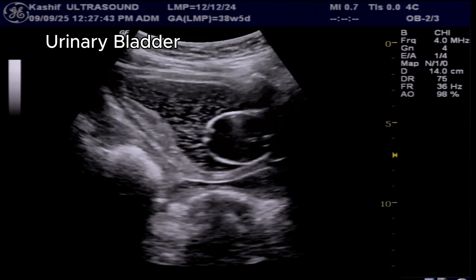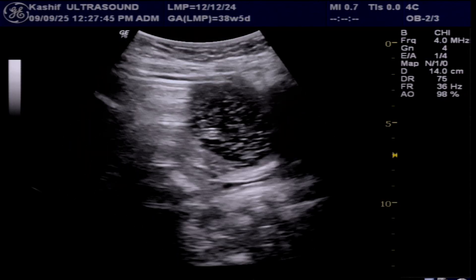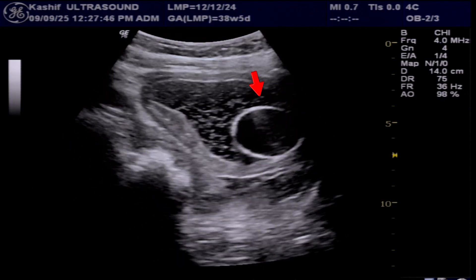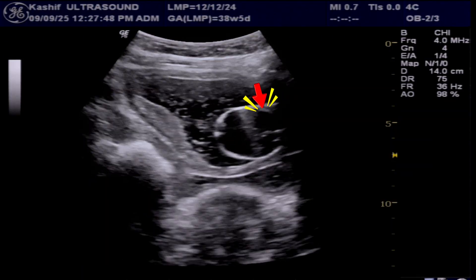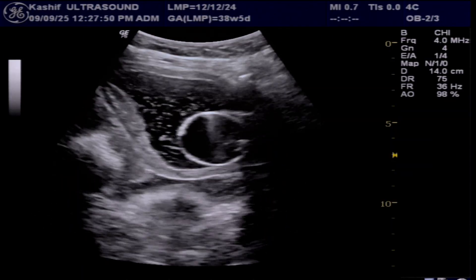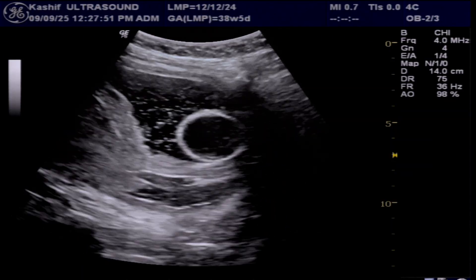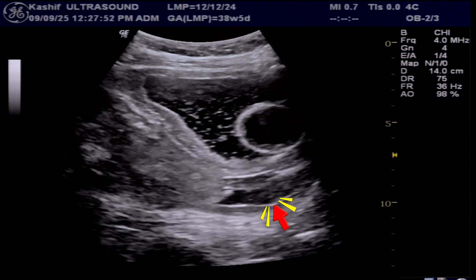This is the urinary bladder, which appears thick-walled. We can see the catheter balloon within the urinary bladder. The vaginal cavity is seen posterior to the bladder.